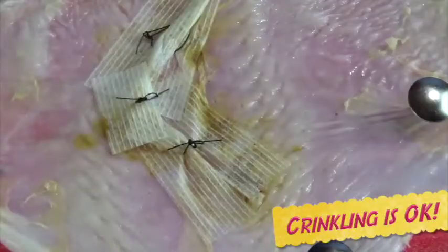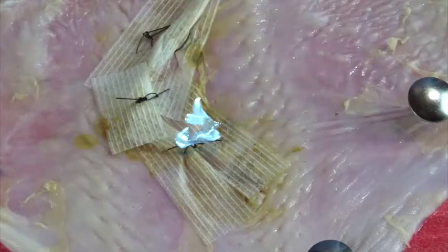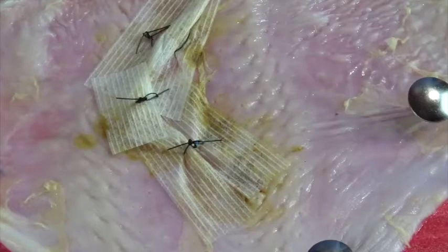One advantage of this over tissue glues is that the patient can put antibiotic ointment on the wound without weakening their repair. Just have them put it right over the suture so it can track through the holes in the steristrips to reach the wound.